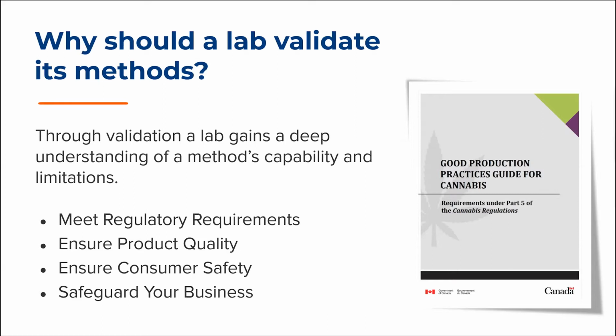The second reason for validating a method is detailed in Canada's Good Production Practices, or GPP, which requires that all methods used to test the quality of cannabis products be validated, thus establishing a regulatory requirement for method validation. Lastly, given that cannabis products are either inhaled or ingested, the use of validated methods is critical to ensure a true and accurate assessment of product quality, which is paramount to delivering a safe product to the consumer and ultimately safeguards your brand and your business.